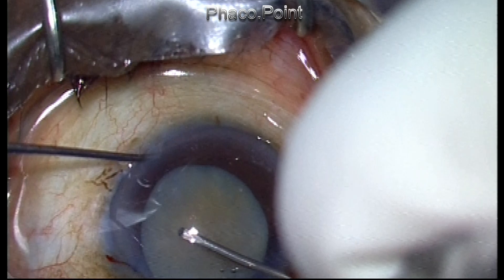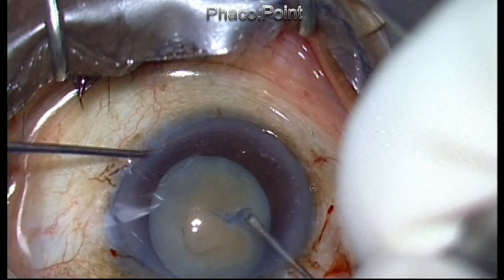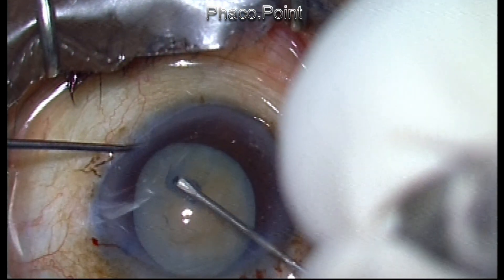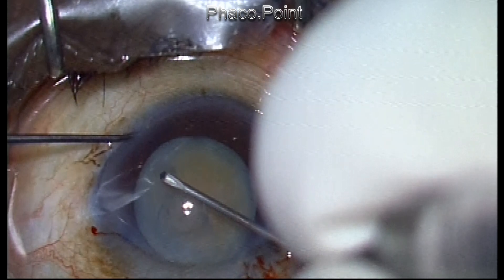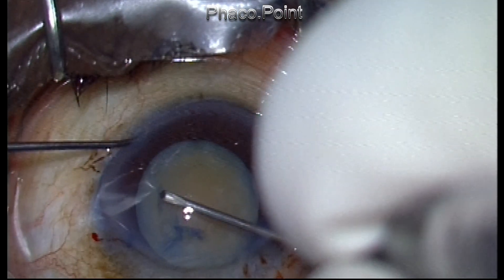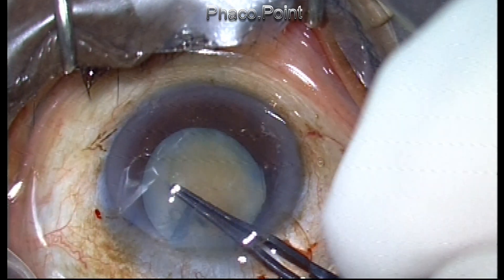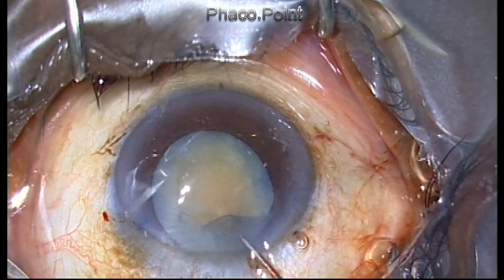The capsular rhexis can be comfortably performed either with a 26-gauge cystitome or even with the help of a utrata forceps, because there is no positive intralenticular pressure. You also see that while performing the rhexis, there is no liquefied cortex coming out. The cortex in this particular case is not liquid but actually quite solidified, as you will see in the end.